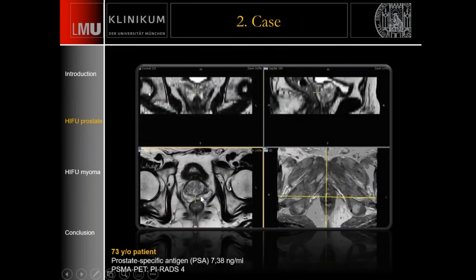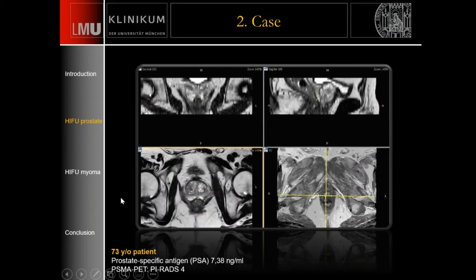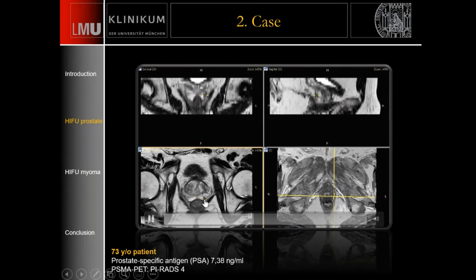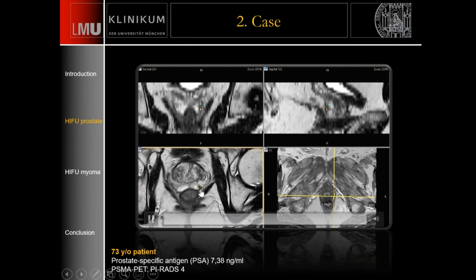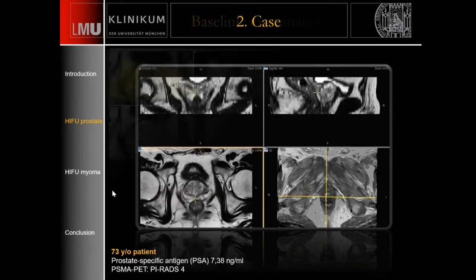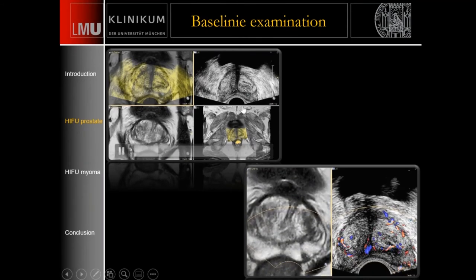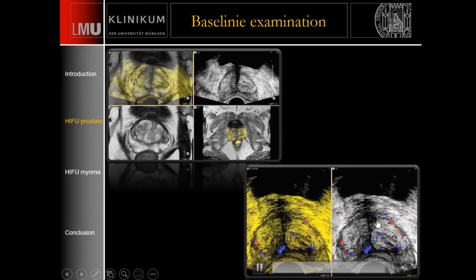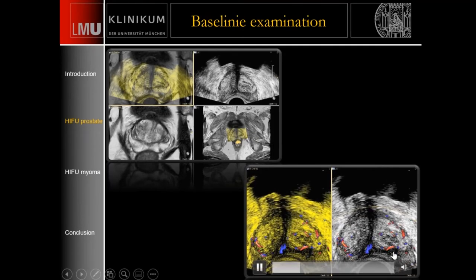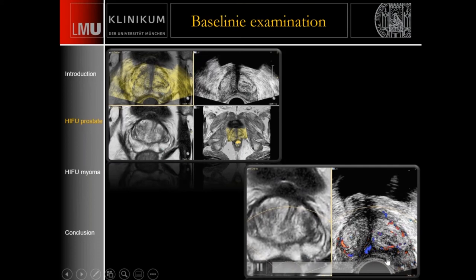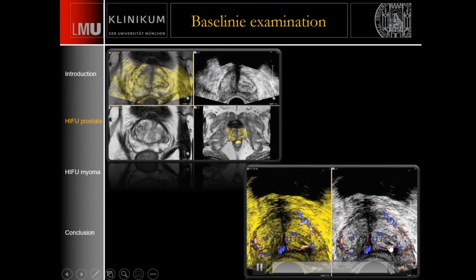The second case: this patient also had a PI-RADS 4 lesion described on MRI, with a PSA of 7. Repeating the examination, you can already see a tiny prostate cancer lesion in the left peripheral zone. We mark this lesion on MRI, and the marker also appears on the ultrasound image. This lesion shows no major vessels — keep in mind this is before treatment, and we will show what happens later.